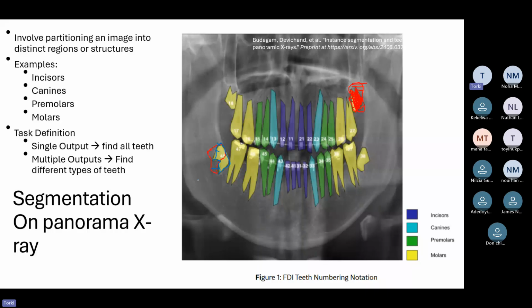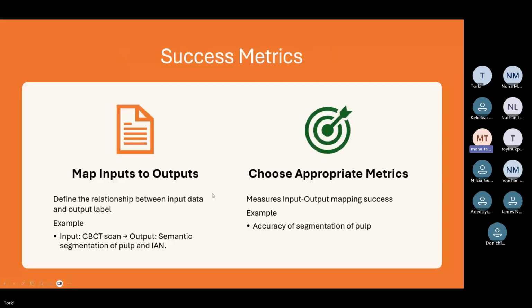You are taking the 95th percentile to allow for some robustness. Because if you took the minimum, it would always give you 0. You see? So you rank the distances and get the 95th percentile. Okay. So these are the two metrics: overlapping quality and boundary quality. Yes. Thank you.